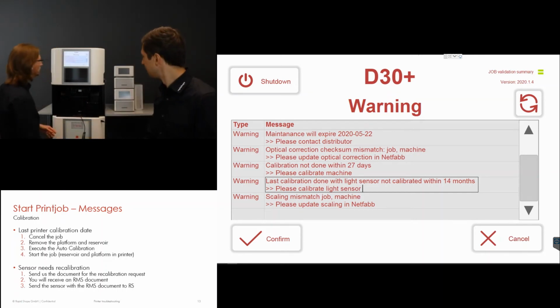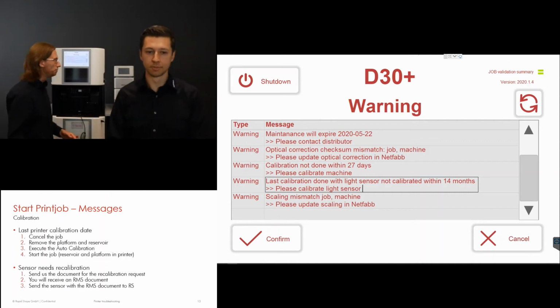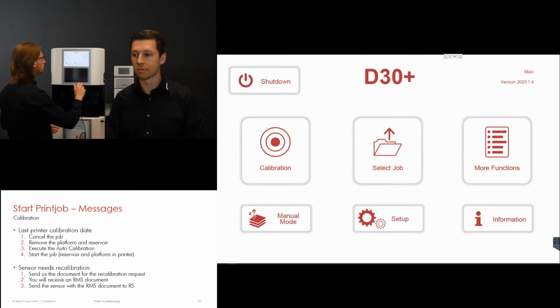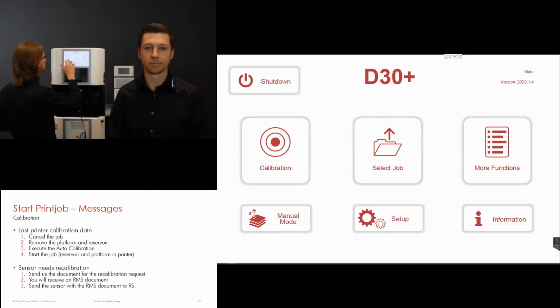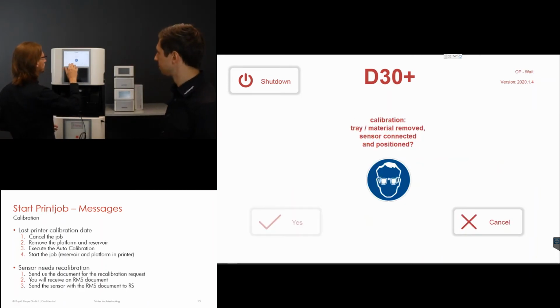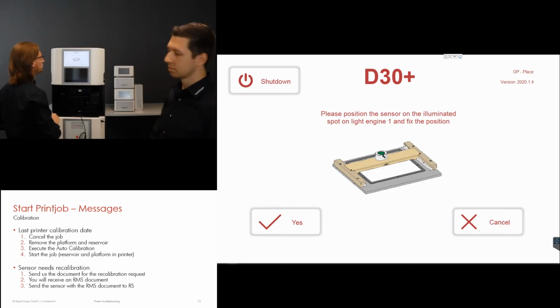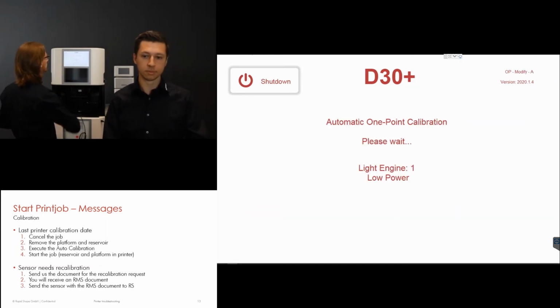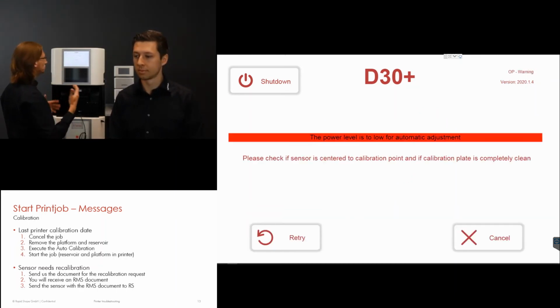All right, so let's perform the calibration together real quick. First of all, we should cancel the warning messages. Exactly. And then I just go to calibration, and let's see what we got here. Yes, I confirm the message, and we also got the information. Yes, we have to prepare it in a certain way. So we have done that. Cool. Let's see what will happen. Maybe we get an error message.